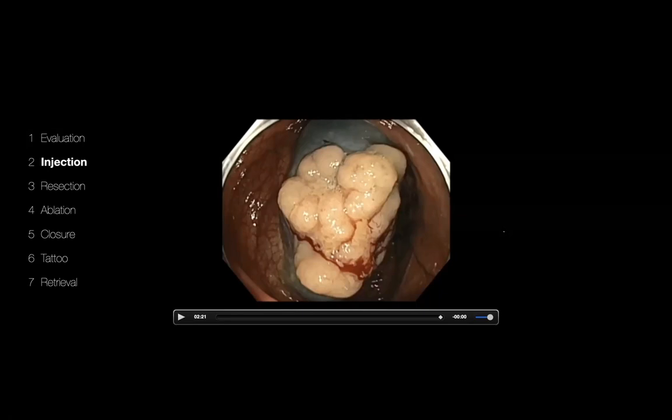the scope has a cap. And the cap is about 2 to 3 millimeters beyond the tip. And this was a screening colonoscopy. Majority of our colleagues in our group have started using a cap routinely. And if I did not have the cap, I would be struggling with this resection.